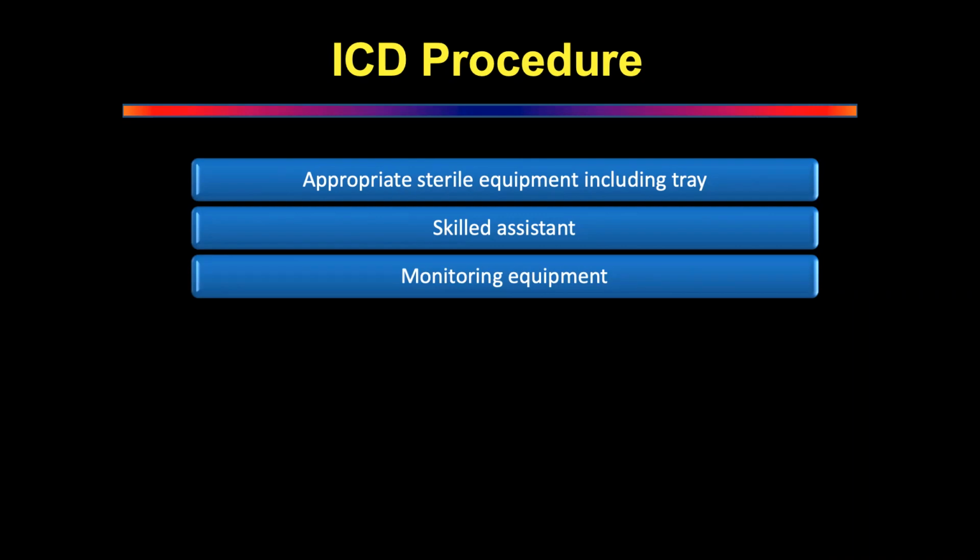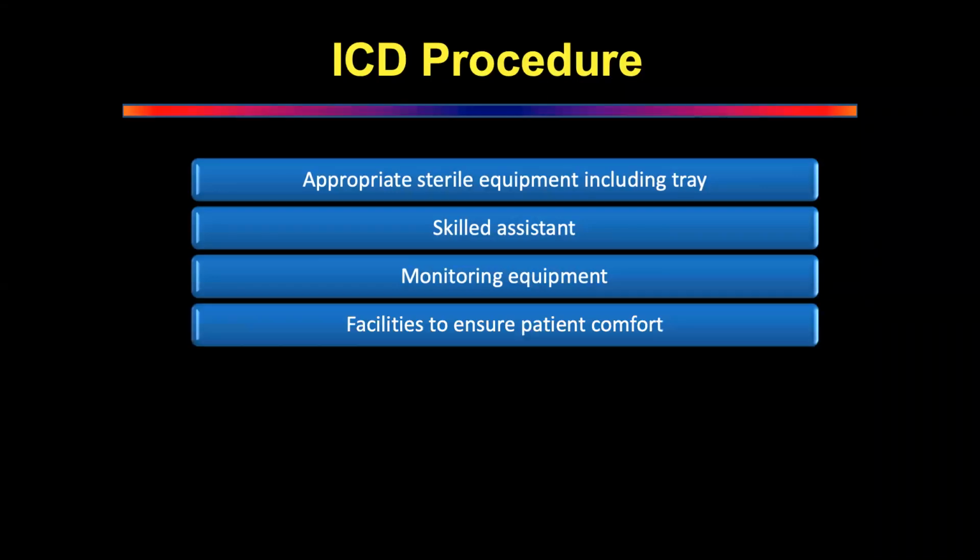Okay. So you look at the blood test and investigations. And what else in terms of patient comfort? Anything you need to make sure about patient comfort? Positioning of the patient. Yeah, so the patient is adequately positioned. You have to make sure that the positioning of the patient is comfortable. He's not sitting in an awkward position for a long time. Okay. What else you have to make sure?